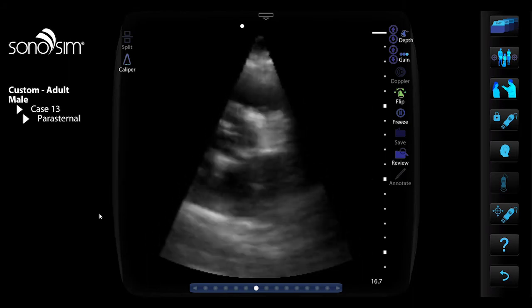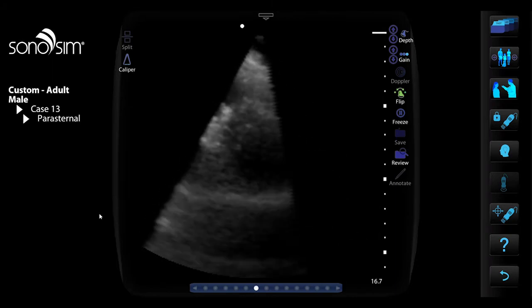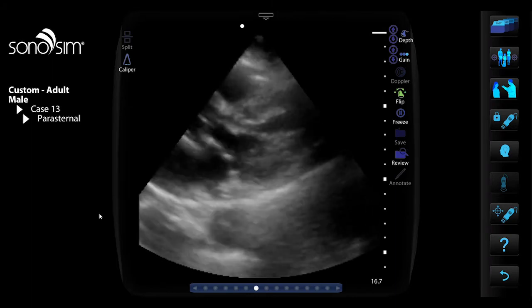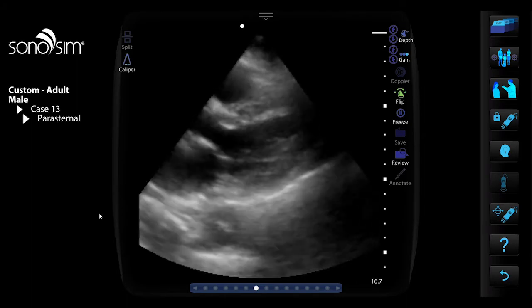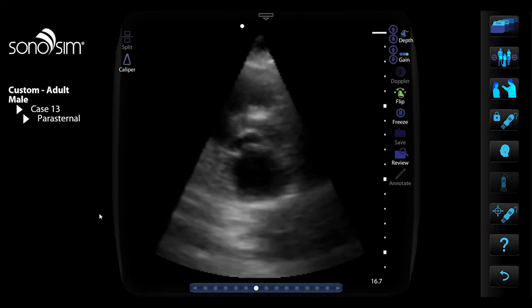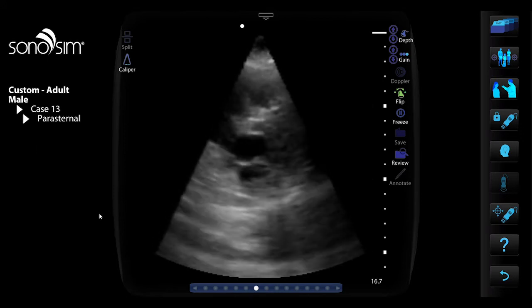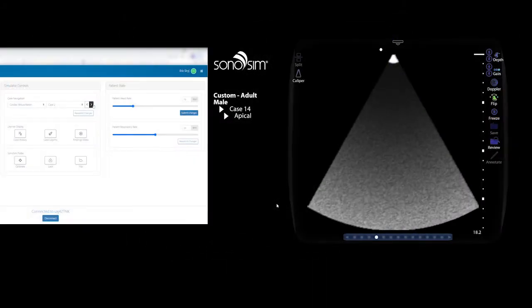After the learner completes their exam, approximately 1 minute, the patient loses consciousness. The vital signs now reveal no palpable blood pressure. The learner should request that airway and breathing support are provided and chest compressions should be initiated. At this point, I will use the case controller to integrate the next physiological state, which was labeled as Case 2. I will set the heart rate of the patient to 10 BPM and now integrate the data set that featured the evidence of tamponade physiology.